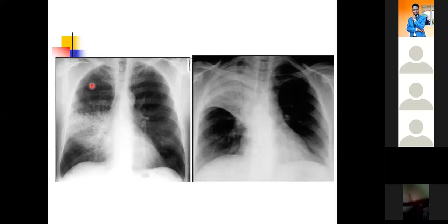That boundary between the mediastinum and the lung tissues must be clear. Similarly, the boundary between the dome of the diaphragm and the lungs should also be clear, just like how you can trace it here. This boundary is very clear for us. Similarly, on the left, very clear to us.